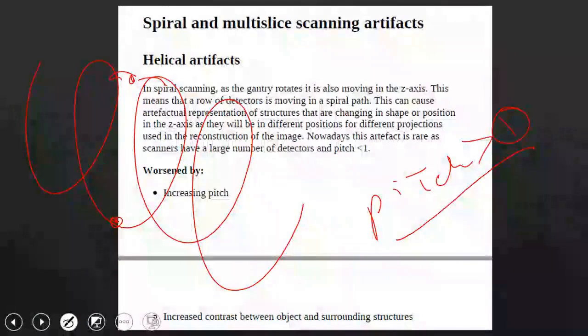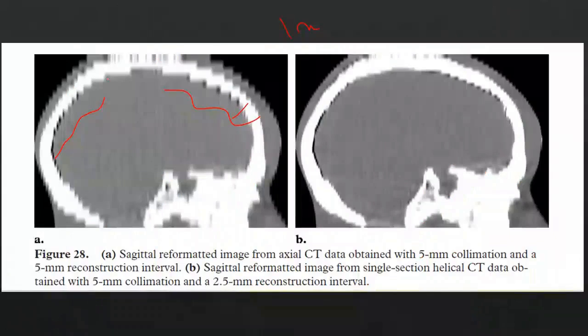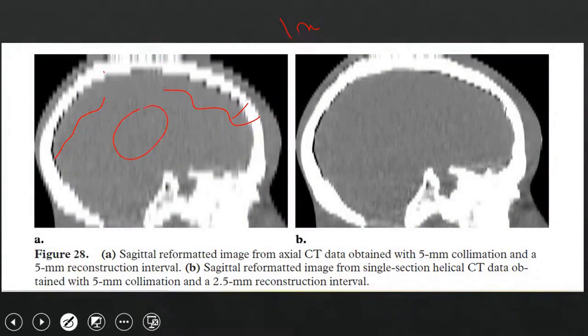Well, this artifact often appears prominently in areas between, for example, bone and soft tissue, but here it might have a minor effect that is not significant. However, with bone and soft tissue, the effect is significant and very noticeable, especially in the areas with attenuation.